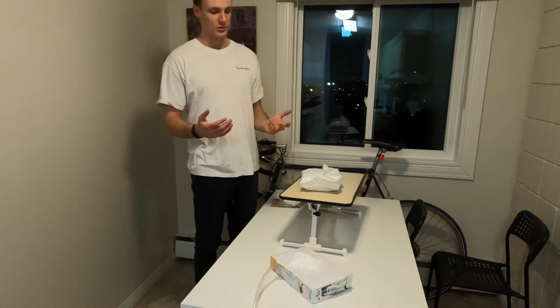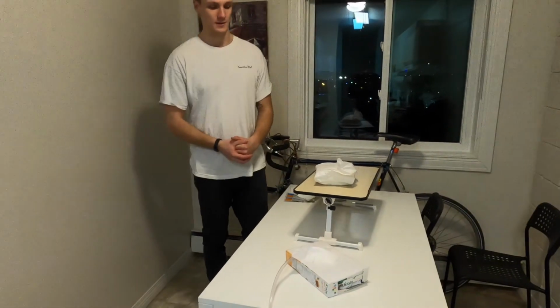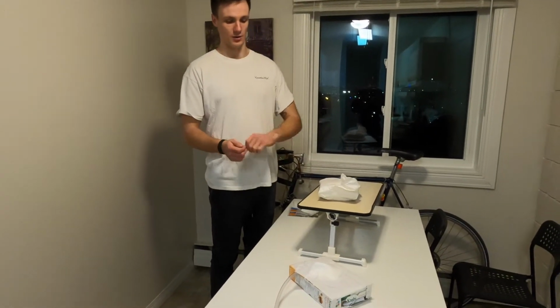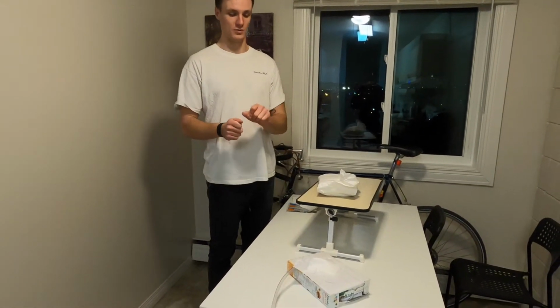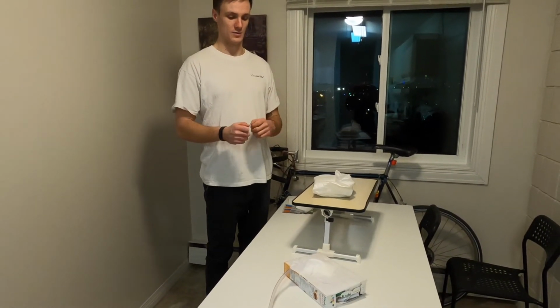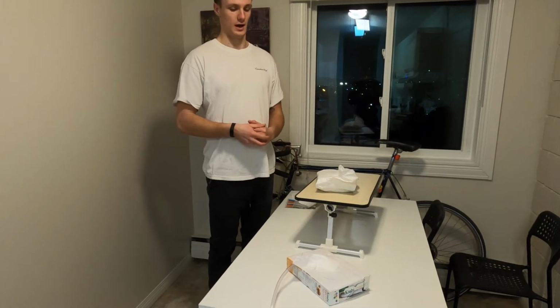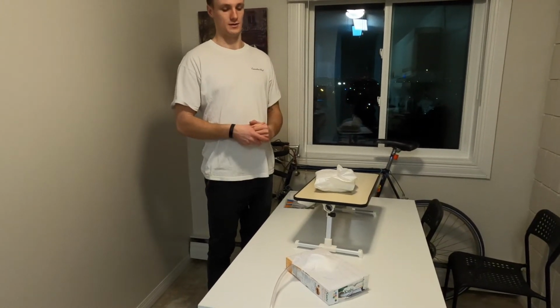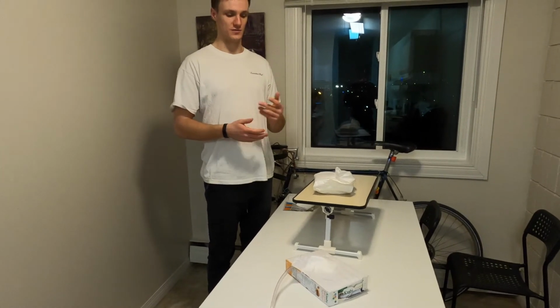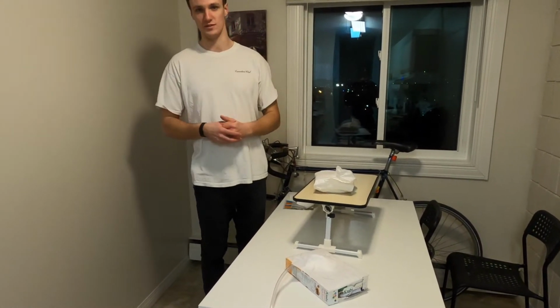So today we will be changing your chest tube dressing. I'm going to be taking the old dressing off, cleaning around the chest tube and the peri-wound skin with normal saline and some gauze. And then I'll be drying the peri-wound and the chest tube before assessing it. And then recovering it with some Gelinet, 1 piece of Gelinet, 2 drain sponges, a 4x4, and then 2 pieces of Mefix to secure it.